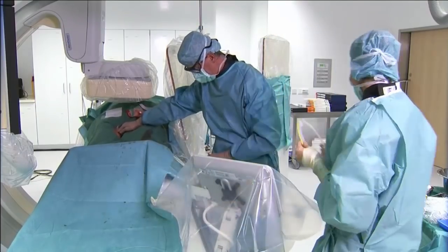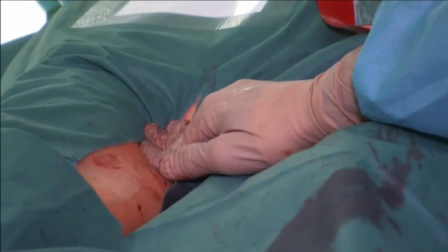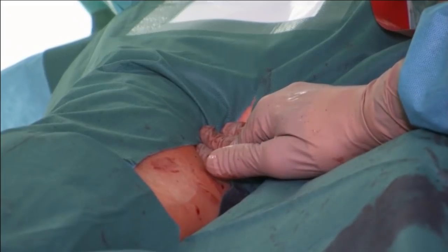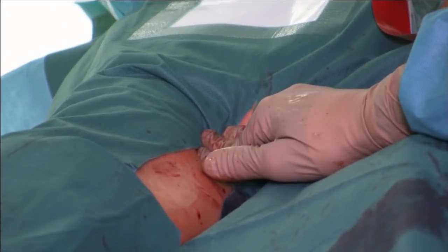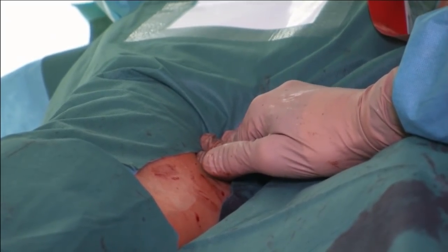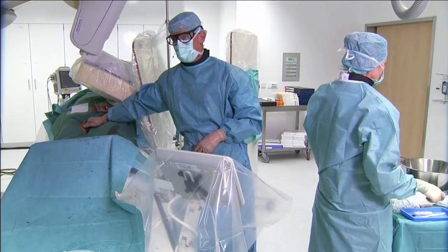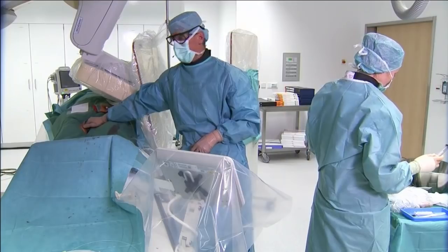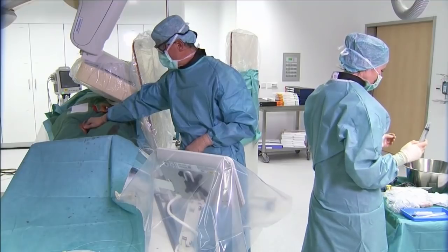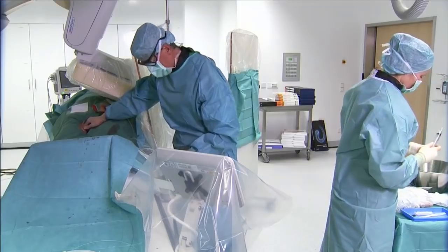So Andrej, what about surgery here? Why not open the groin, find the vessel, and connect it if it is disconnected? Yeah, and that means the third time surgery. It's under local even; you don't have to give general anesthesia in this area. But we indeed discussed with our surgeons, and due to the fact that there's so much scar around, we agreed that we give it an endo attempt first before we try surgery. That was the reason.